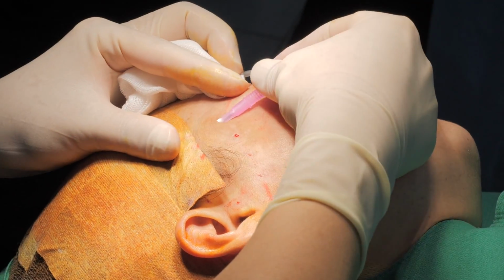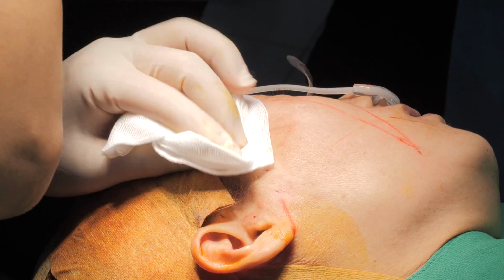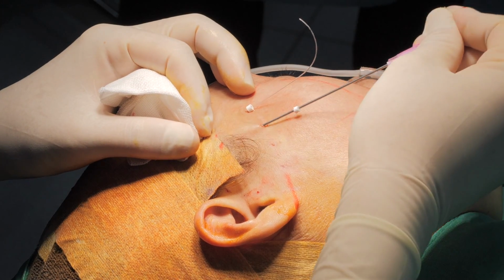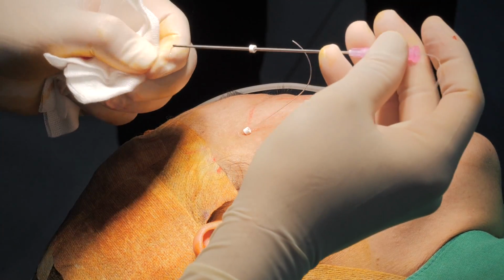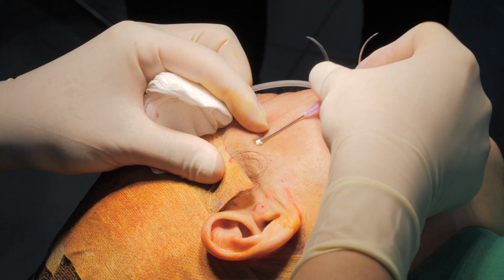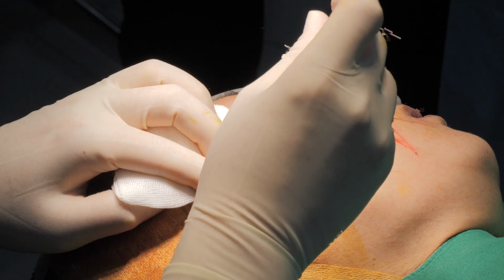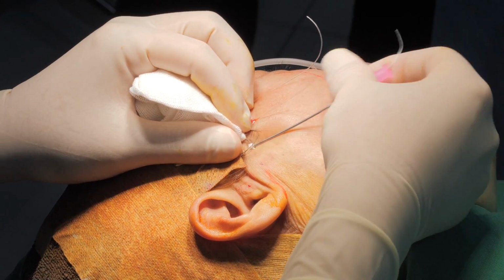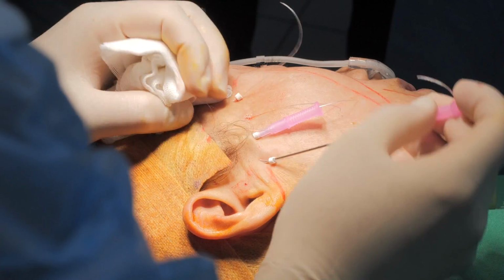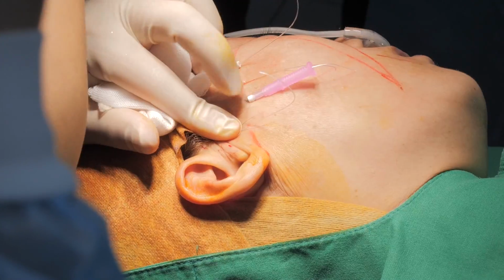Also the same. I can insert these two threads obliquely, laterally. When I meet resistance, I go back and try again. Do you always use the same ratio of PDO as the other ones? No, it depends on each patient, definitely.